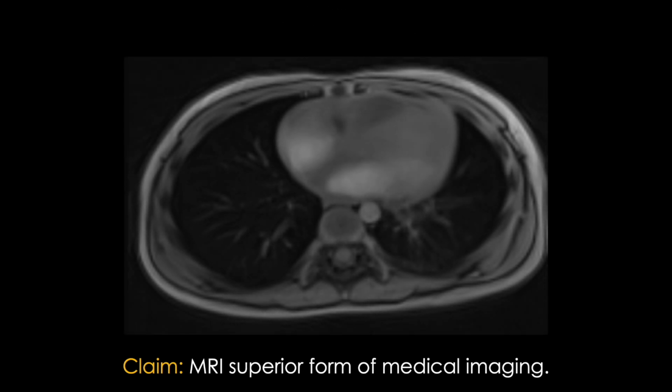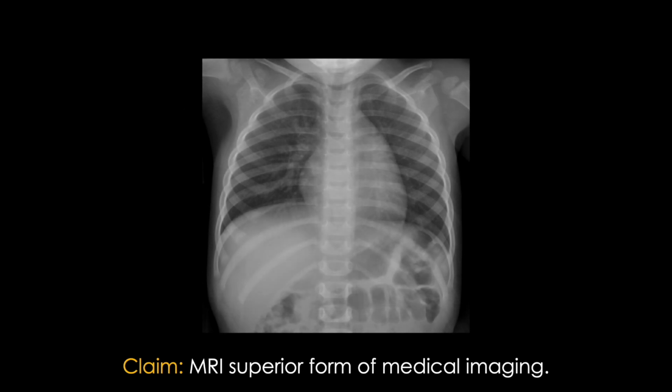What if you're worried about pneumonia? Does this multi-$1,000 MRI of the chest show more detail than a cheap old-fashioned X-ray? I think you get the point. The superiority of medical imaging really comes down to what it is you're hoping to assess for, and which imaging modality is best visualizing it, whether it be an MRI, CT, ultrasound, or a plain old X-ray.